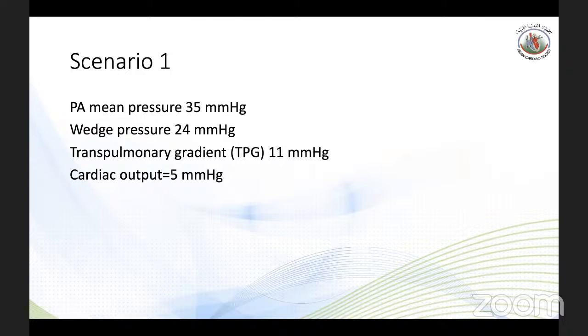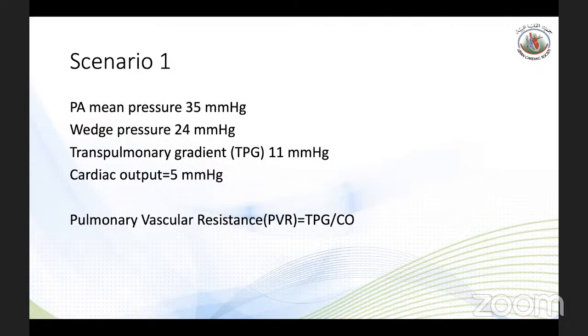Second, when it comes to those people you operate on with pulmonary hypertension, especially moderate to severe, sometimes you have almost systemic pulmonary hypertension. We send those for the right heart cath to find out if there is an element of reversibility of their pulmonary hypertension. Could you elaborate on what to do when testing for reversibility? If you measure somebody's pulmonary vascular resistance at 6 or 5 units, do you provide additional information to tell me this is reversible, that if you fix the left side, if you replace the mitral valve for mitral stenosis, this is going to improve, or this is a fixed pulmonary hypertension, because it means a lot to the outcome of the patient.